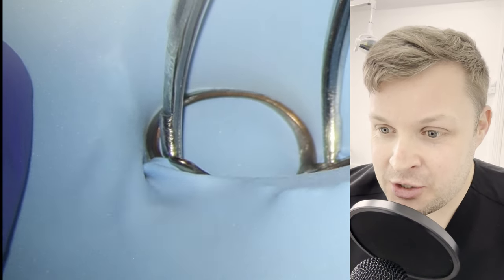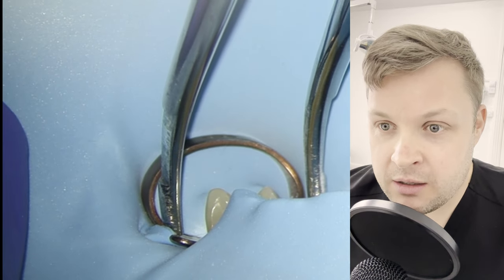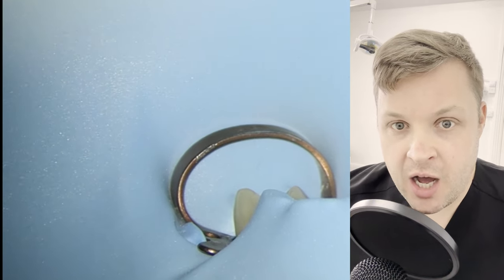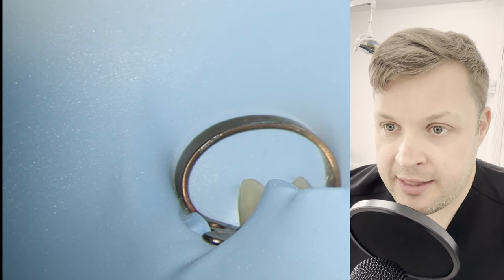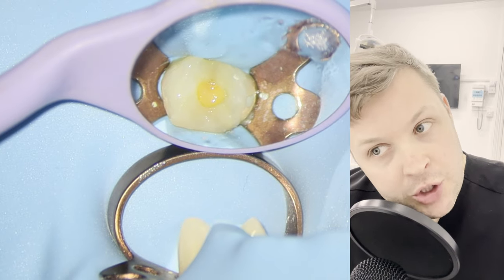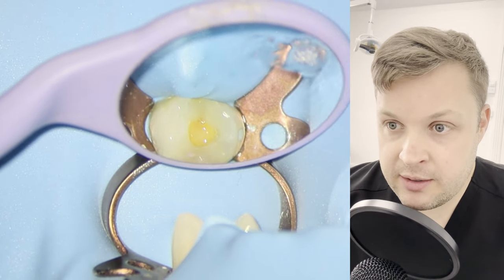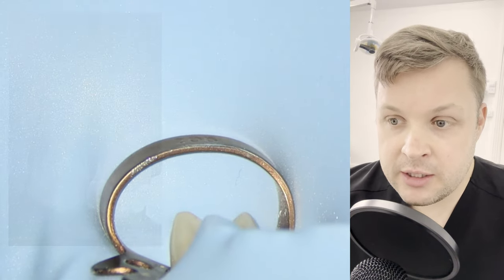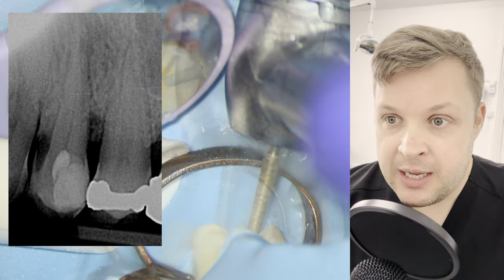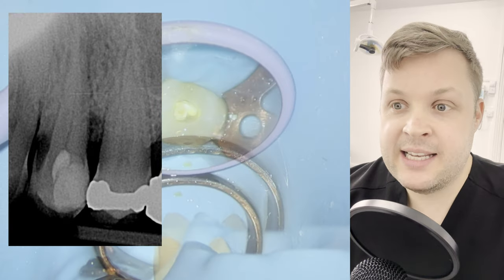Welcome to this interesting case we had the other day. This is a root canal on an upper left four. There was a suspicion halfway through this root canal that there possibly might be a joining canal. The patient attended with pain, and upon looking at the x-ray, we could see there's an apical infection, and the tooth has already been accessed by another dentist.